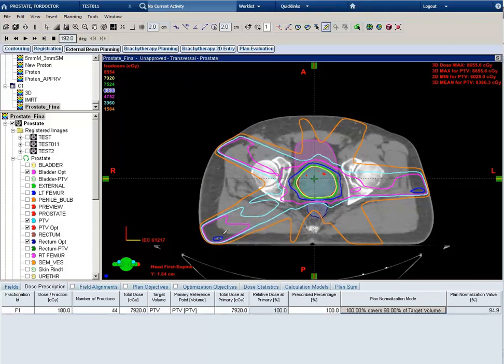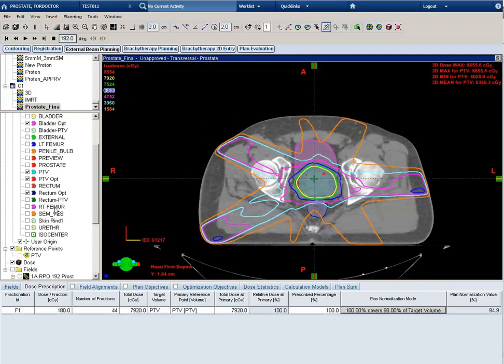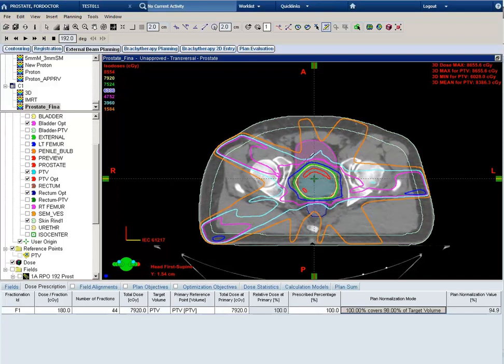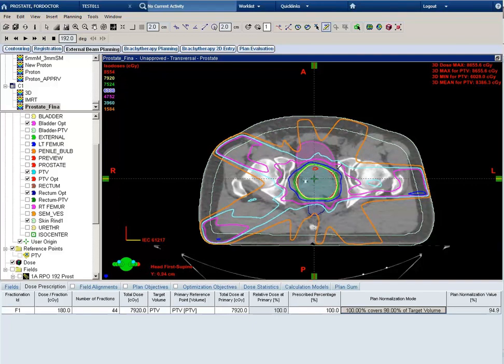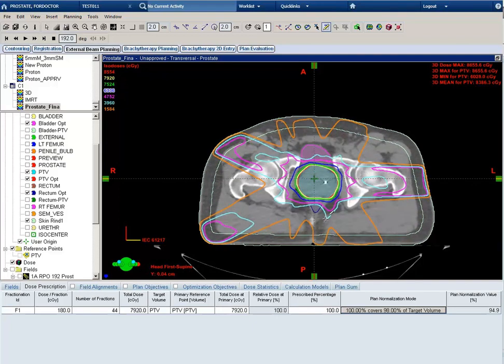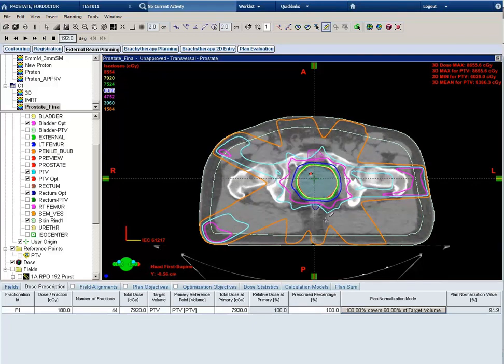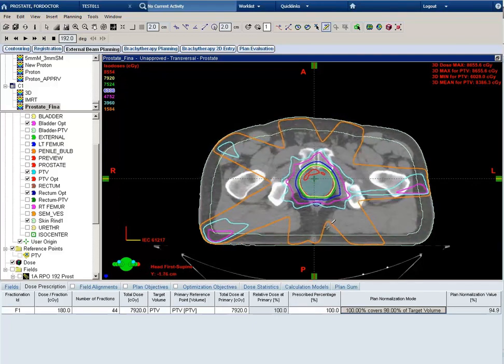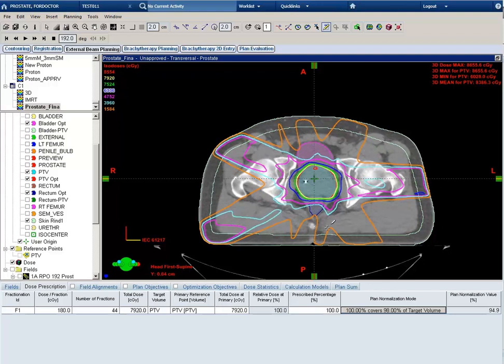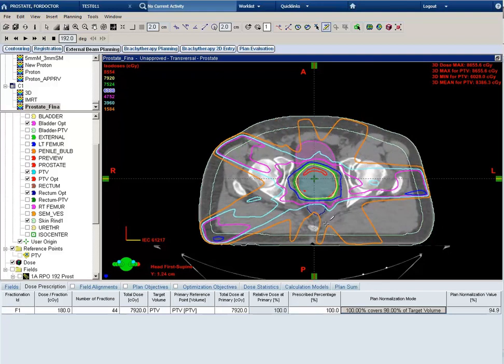The next thing to note is the high dose in the periphery. If I turn on the skin rind contour, you can see that this high dose exists right within the skin rind contour. So I can use that to decrease the periphery dose. Also note that the 50% isodose line does a fairly good job of wrapping around the rectum and bladder opt, but we can improve the sparing by increasing the priority in the optimization.